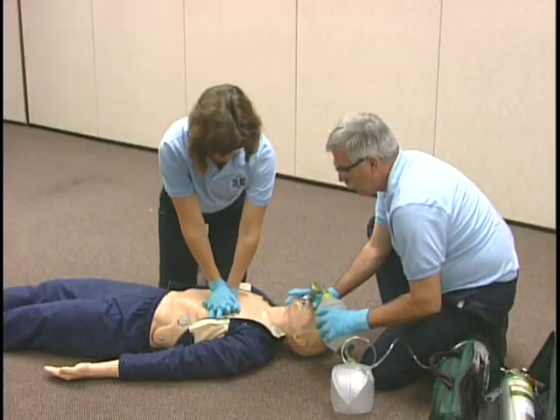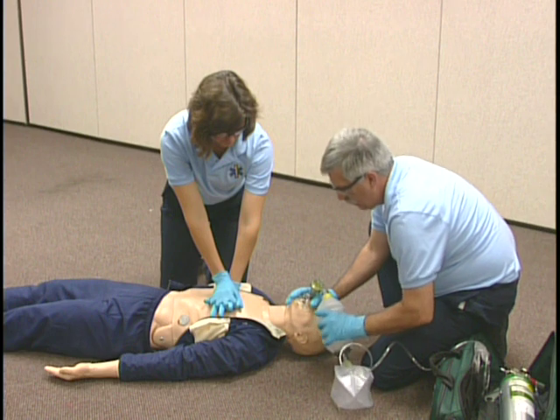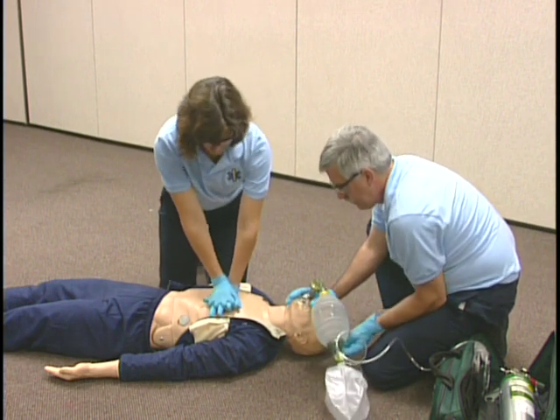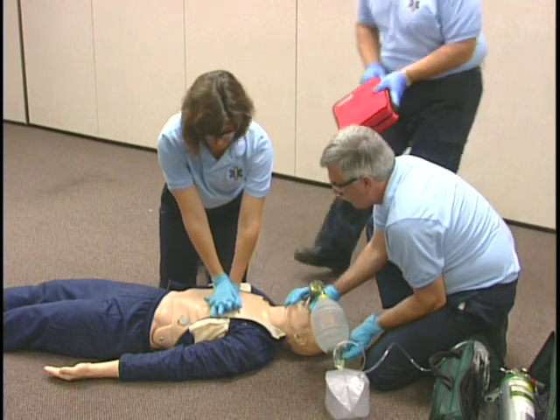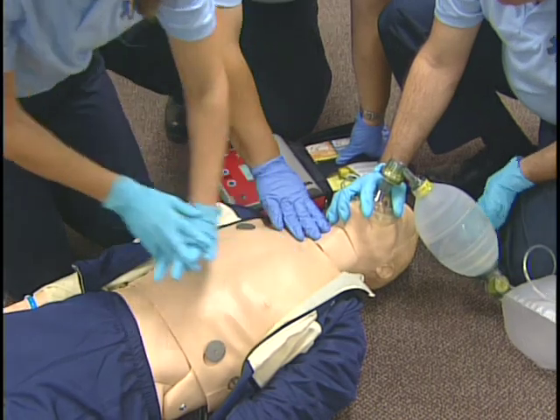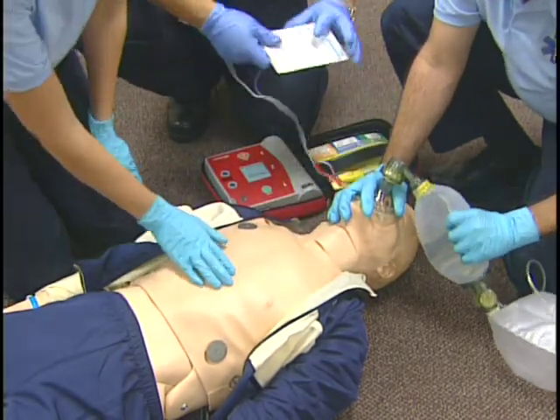In considering usage of an AED, perform an initial assessment to confirm the patient is in cardiac arrest. If CPR is in progress, stop compressions and ventilations and verify apnea and pulselessness. Stop CPR. There's no pulse. Continue. Resume CPR.